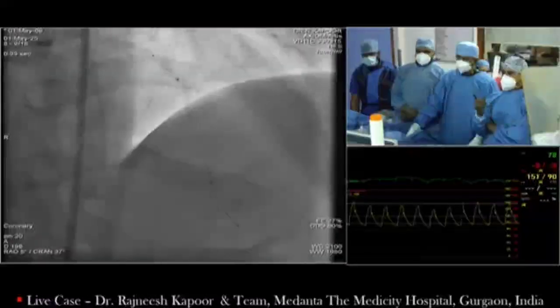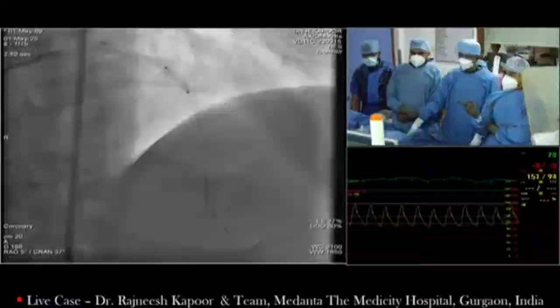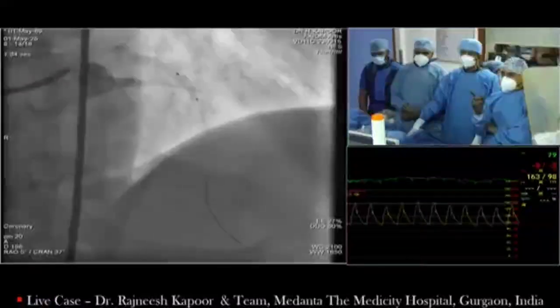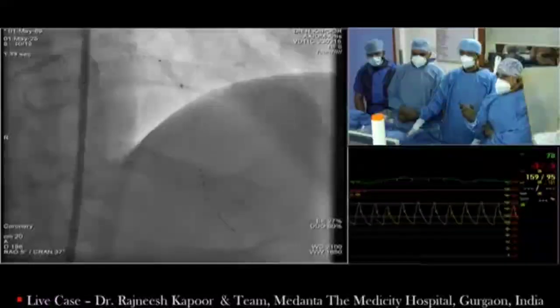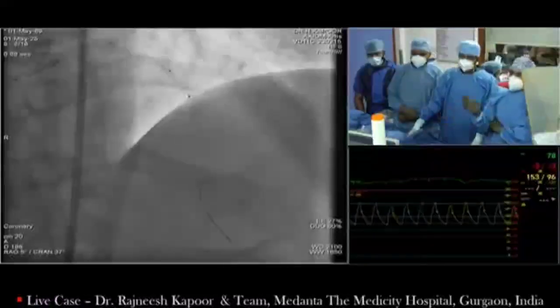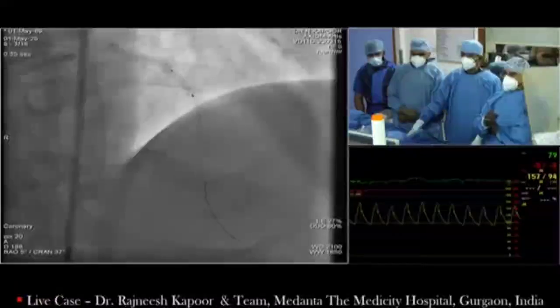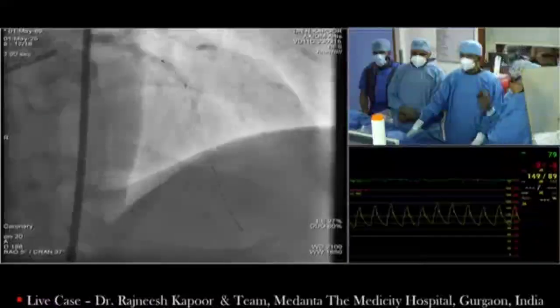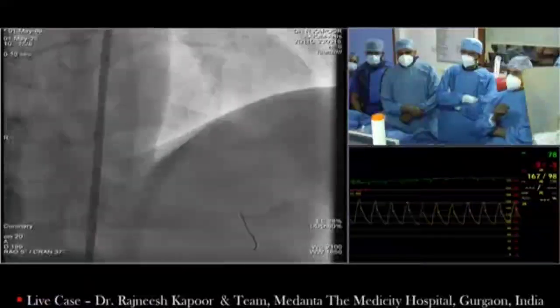Okay, so this is where we had to change to a Viper wire. We were planning an orbital and were prepared for it. We didn't expect a non-crossable lesion here. We thought we'd pass our Viper wire easily and do the orbital to the whole segment. Then, after the modification, we should be better off with the vessel and stent it. And this is the Viper wire there now. So after this, we started.